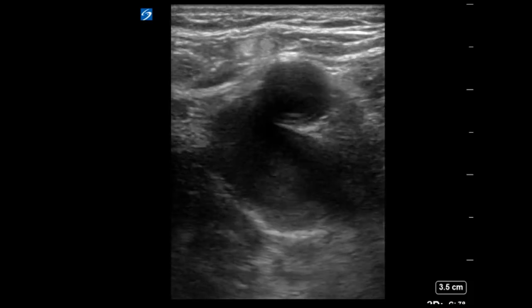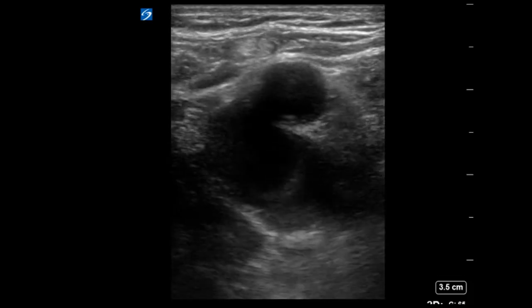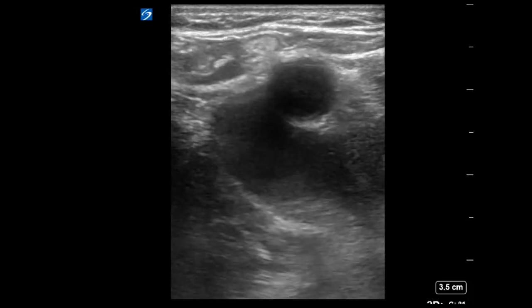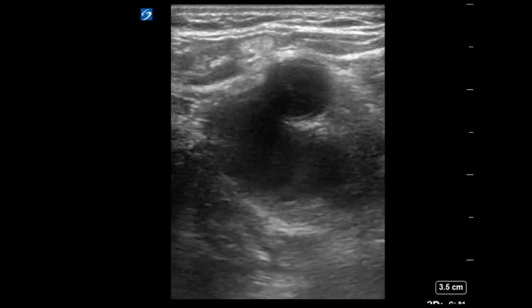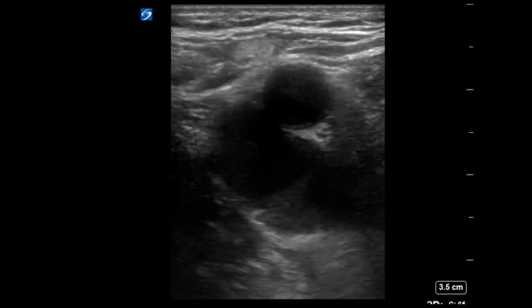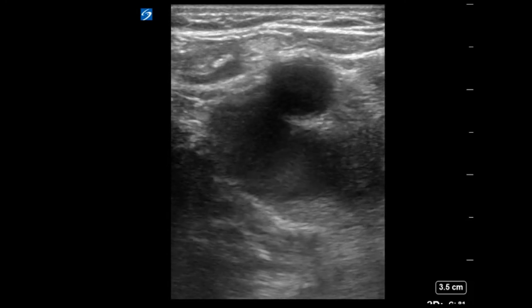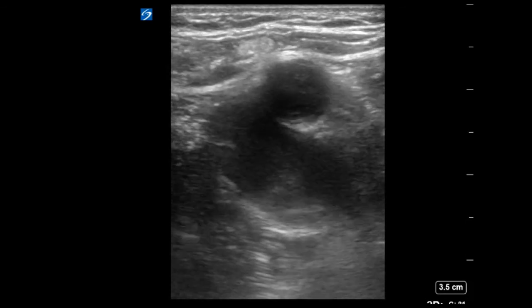Lastly, take a look at this vessel. Here we see echogenic material in the vein that seems to have turbulent movement. This is known as smoke or rouleau formation, which is a common finding with modern machines but is not known to be pathological. The vessel should still be compressible, which highlights why a positive DVT study requires a non-compressible vein, not only an echogenic vein.